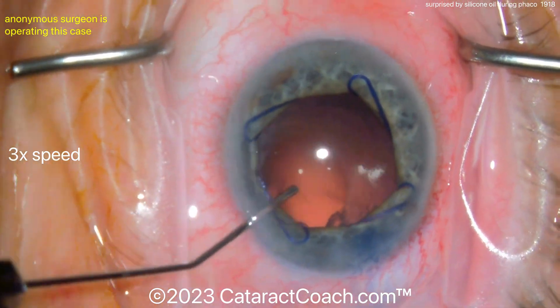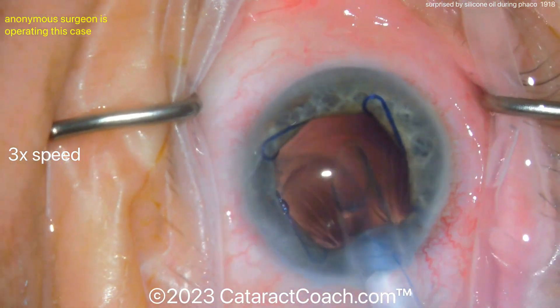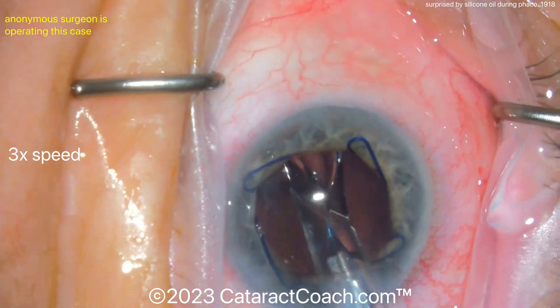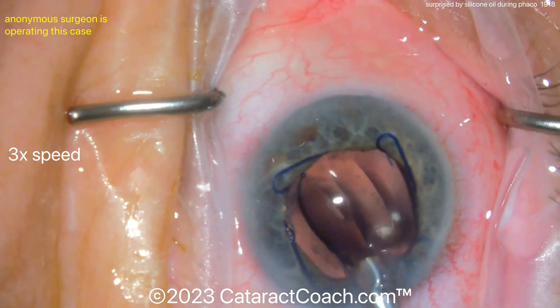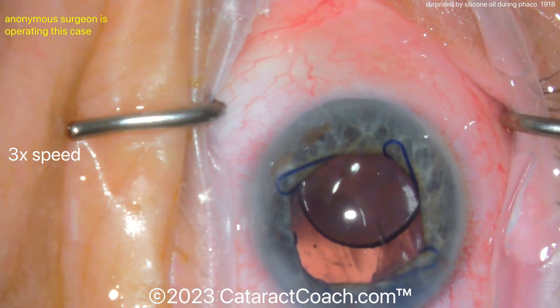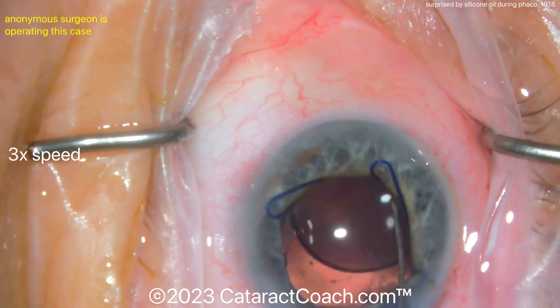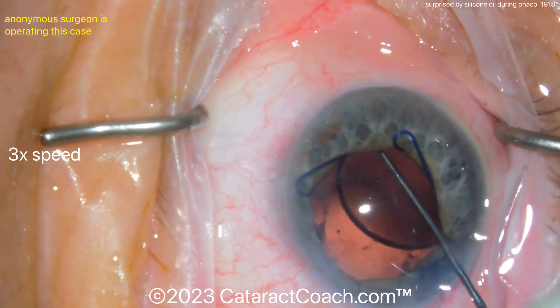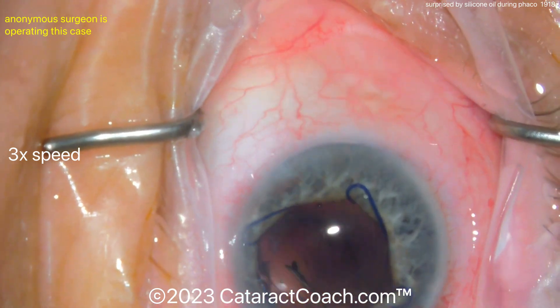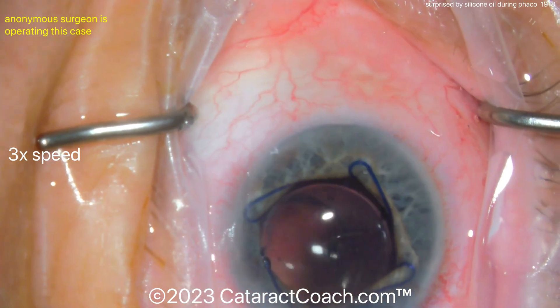The surgeon has tried to tamponade as much as possible, but there's a big opening in the posterior capsule. This patient is going to need a three-piece lens — probably in the sulcus, hopefully with optic capture behind the rhexis with haptics in the sulcus. Do not put a silicone IOL in an eye with silicone oil, because the oil droplets will stick to the silicone optic and it will be impossible to remove. You definitely want a monofocal hydrophobic acrylic lens. Optic capture will also help create a barrier to prevent more prolapse of silicone oil.